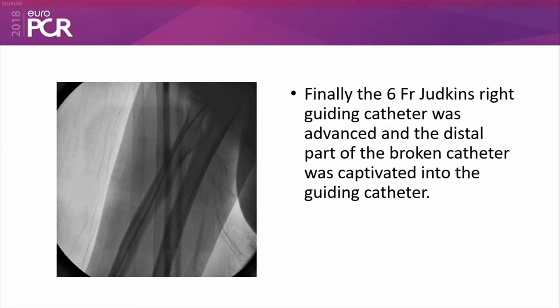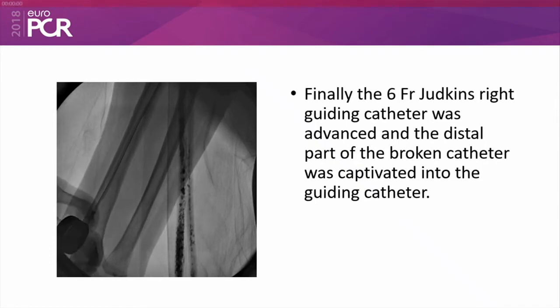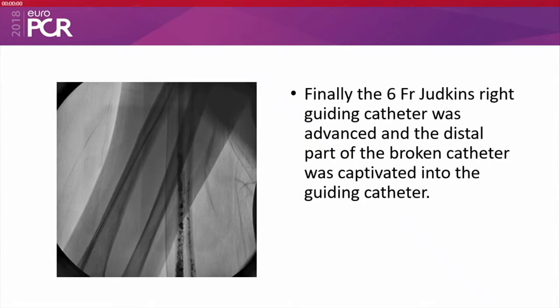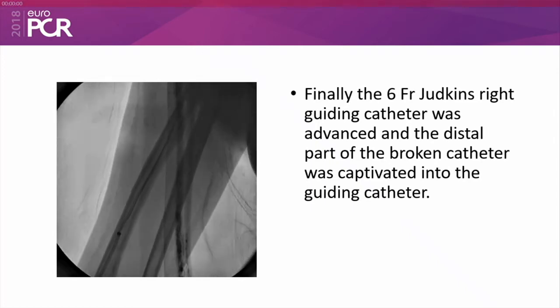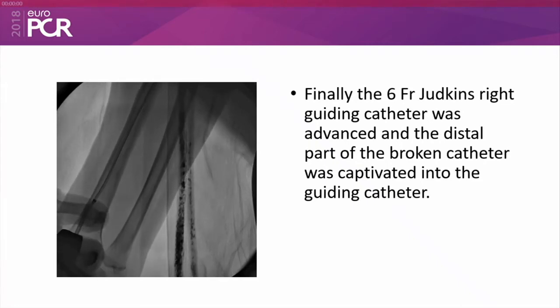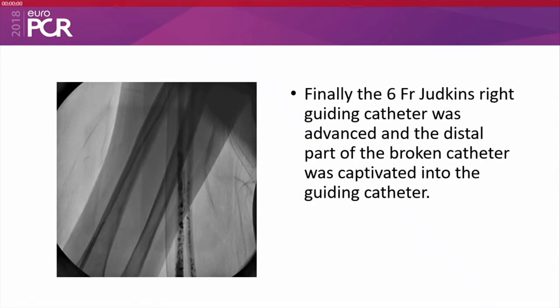The other advantage of a BP cuff is that you induce ischemia-mediated vasodilation, which would also be very useful. And the technique which is also described, instead of using a JR4, is to exchange to a long sheath, which sometimes can do a similar thing. I think a BP cuff may be a good option for external fixation, and would be an excellent option in your case.